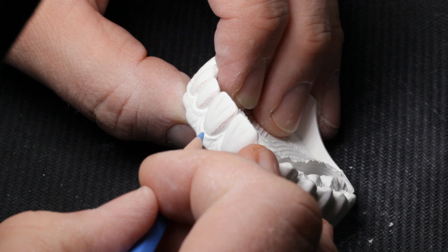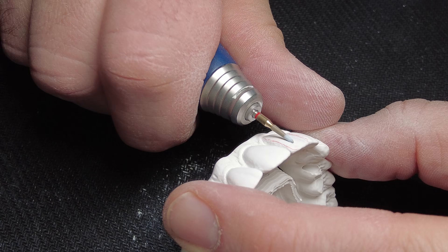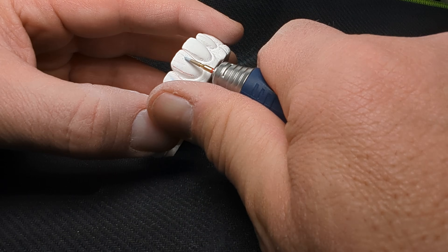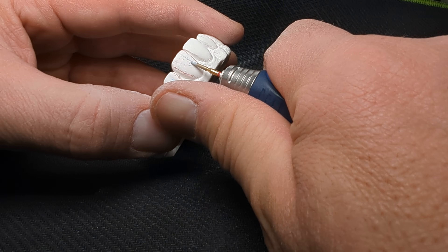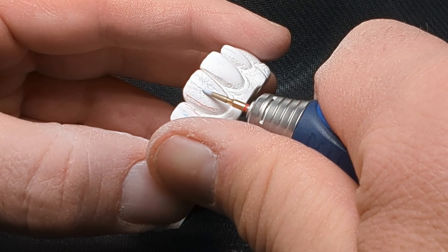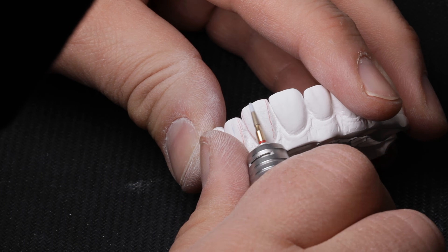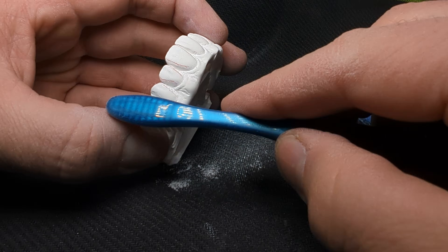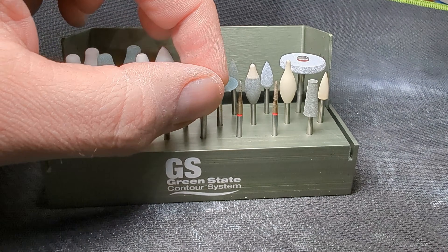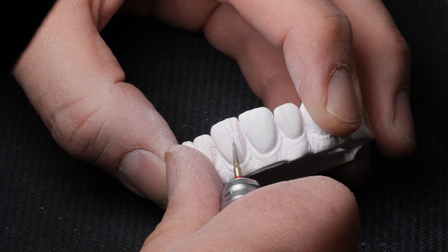You have to remember that zirconia's green stage is about 20% larger than sintered zirconia. Therefore, everything you apply in the green stage will be smaller and less visible after sintering. Surface texture is one of my favorite things to do. A crown always looks more natural and has light reflections interorally — a smooth crown covered with saliva will appear fake and like a jelly bean.